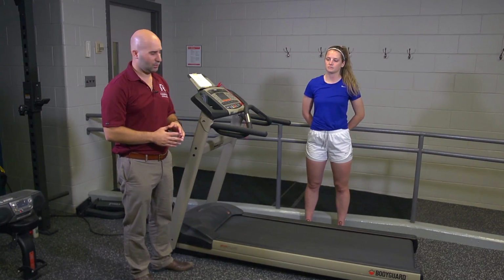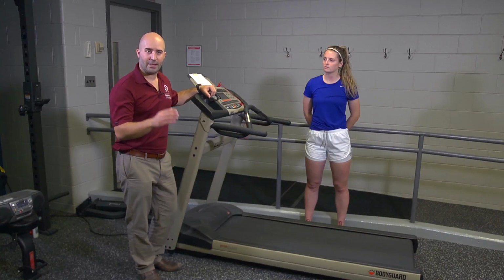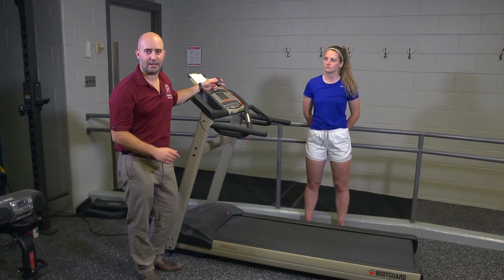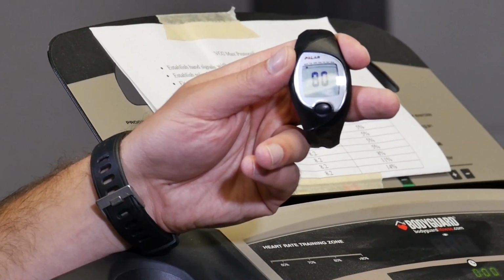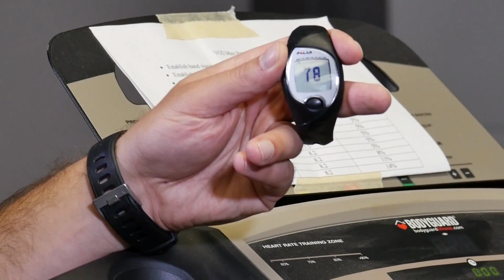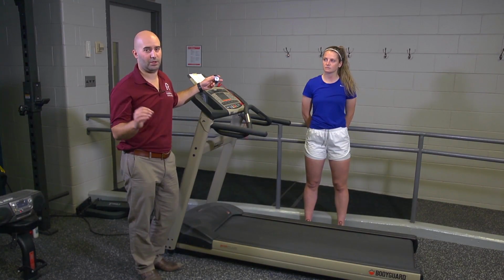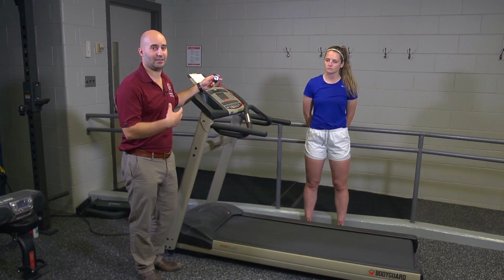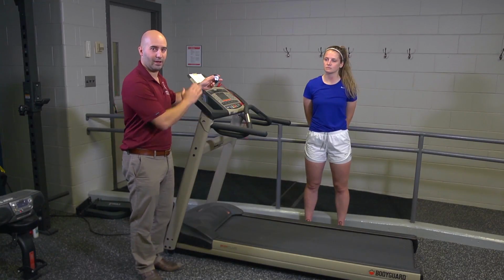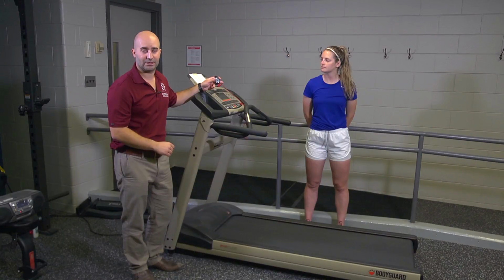So for the sake of this FluBu course, it's the only test where we'll allow the use of a heart rate monitor. If you are trying to get your CSEP certification, depending on who your instructor examiner is, they may or may not allow you to use a heart rate monitor for the MCAF test and the ergocycle test as well. But for the sake of the FluBu course, this is the only one, and you'll be using manual methods of heart rate measurement for the other 2 tests. So in that respect, this is also slightly easier for the tester as well, because you just need to read the watch, or sometimes the treadmill will pick up the frequency as well.